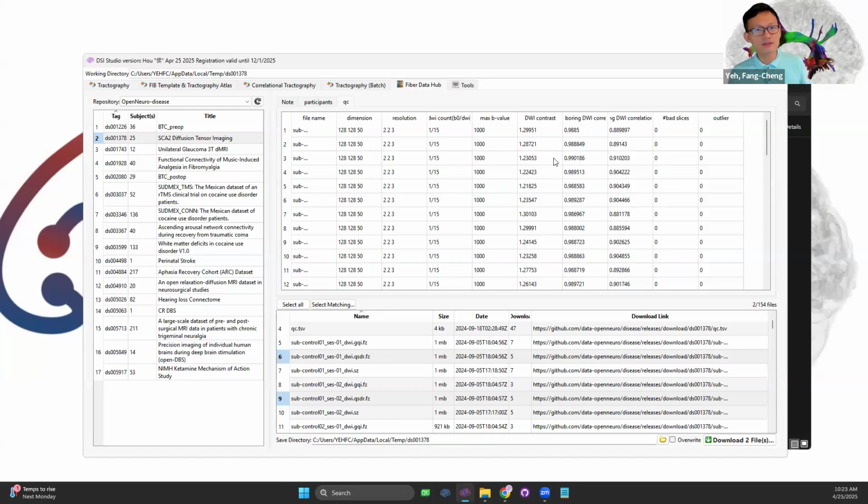And the second is, for QA, there's a remaining problem of normalization. In all the patients, their anisotropy has decreased all over the brain tissue. So consequently, the QA may not be accurately normalized against itself. Right now, the QA value is calculated assuming that the maximum QA is 1.